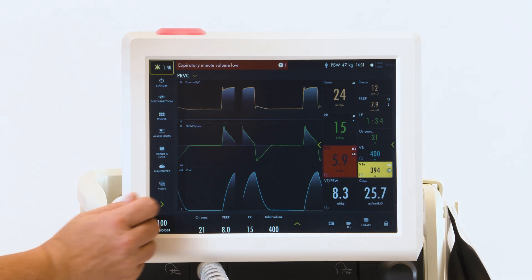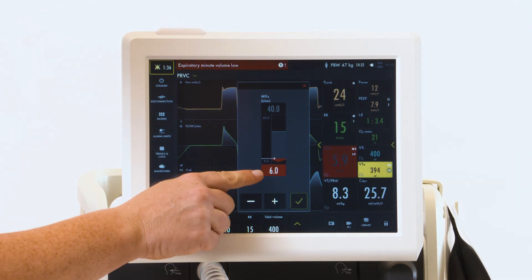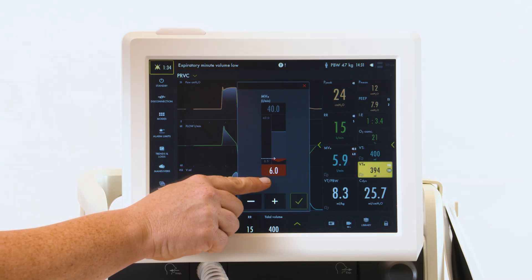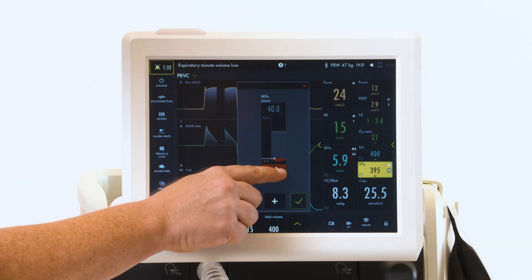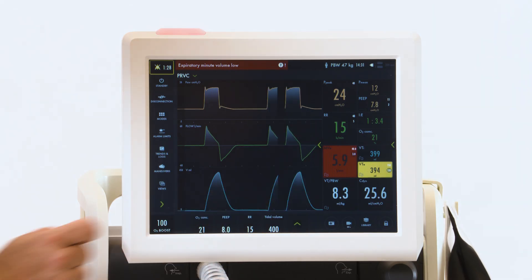In order to make an adjustment, touch whatever is alarming. You can see it's the low alarm limit. You can pull that down or you can add and subtract and check mark to confirm.